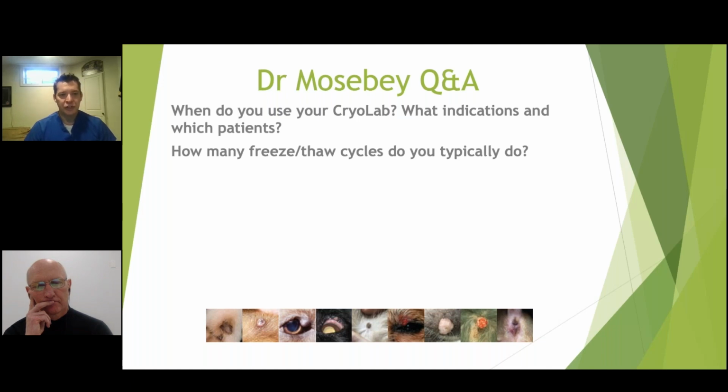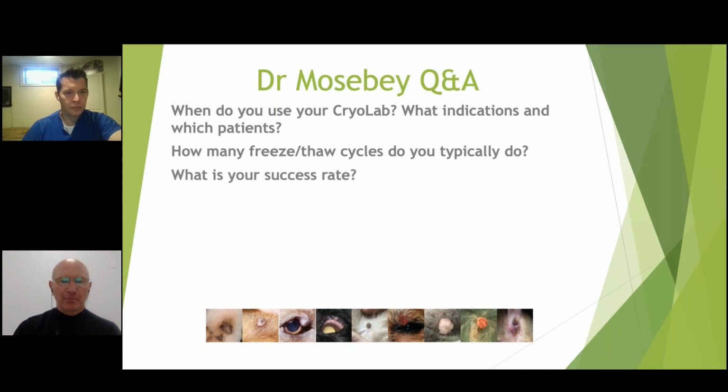If it's a bigger lesion, I think it's better to do your 3, 4. You're hopefully going to reduce its size by at least 50%, sometimes 90%, and have them come back in a couple weeks and repeat it if it's one that one treatment's not going to totally resolve. Yeah, and we'll talk about success rates next. That's actually a perfect segue to that next question.